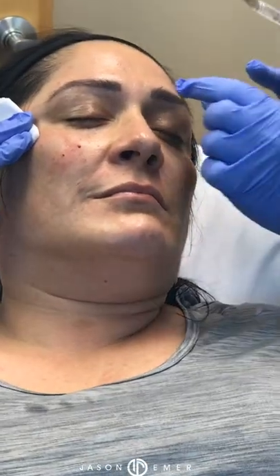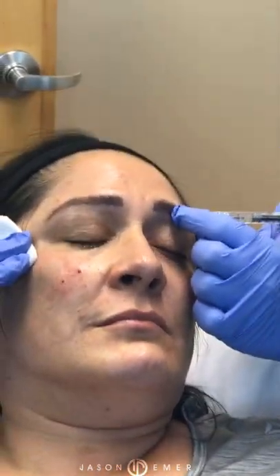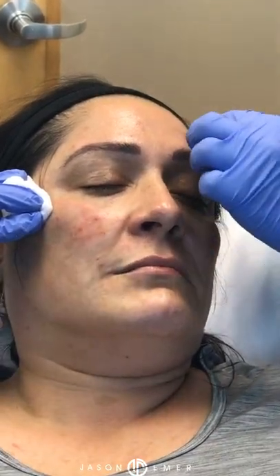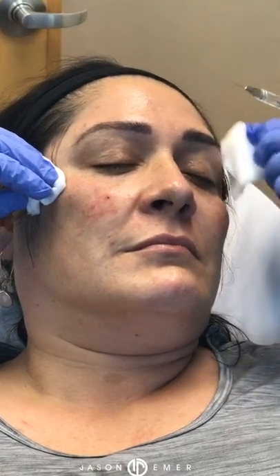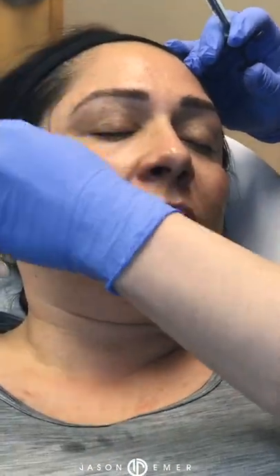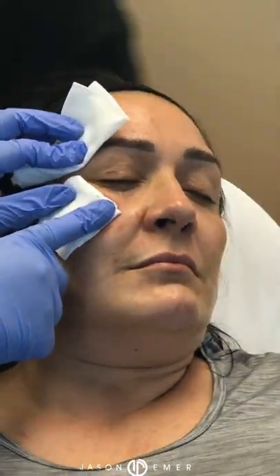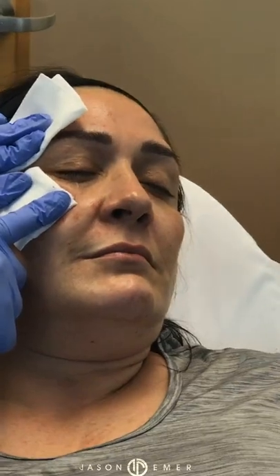And we're all blending now. So again, that little spot right under the brow. Nice and slow, right into this safe area. You can see it's giving a nice lift right there. Good. Good, hold right there for her, nice and hard. And then your other hand, hold right there. Everywhere you go, you want to hold pressure, because the pressure is what limits any bruising and swelling.